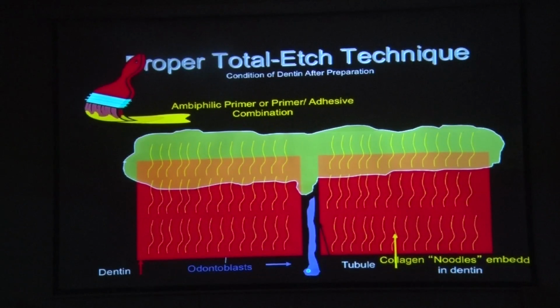Know which kind of adhesive, what kind of solvent you are using. Whether it is an acetone based, butanol based, water or ethanol based. Everything has got some significance. These are some small things which makes a huge difference. Now say for example I use an acetone base which is the classical most popular Prime and Bond NT. Now acetone has got high vapor pressure, so it evaporates very fast. So it gives you very little time to work with. So you have to be literally very quick, just 20 seconds and you're off.